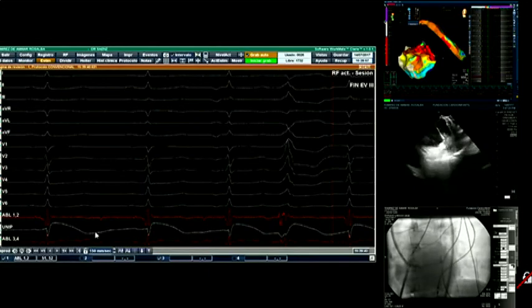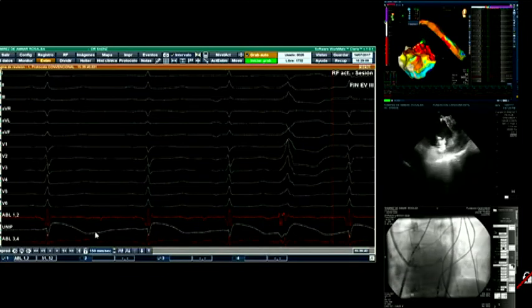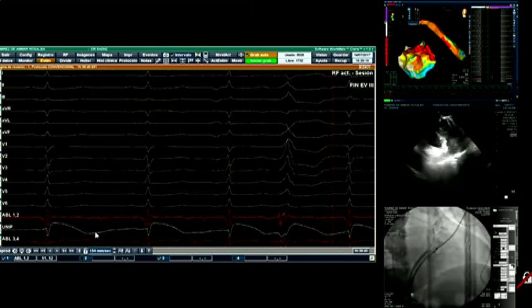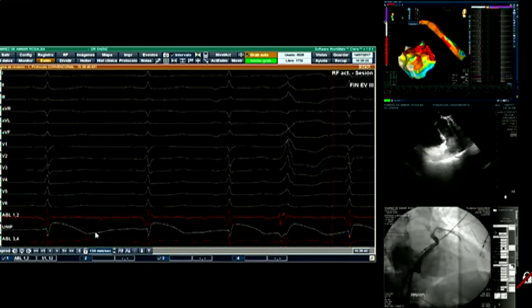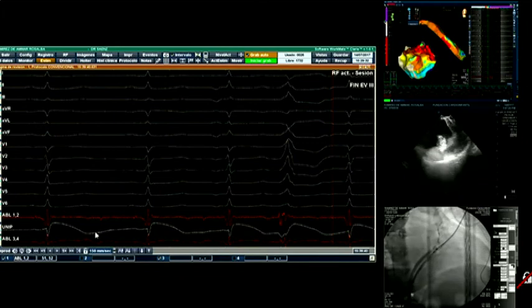But what I say is that in this case, we didn't do any extraordinary manipulation. This is very simple. The reason for the previous perforation has nothing to do with entering the coronary sinus. The reason for the previous perforation probably had to do with trying to place the catheter and the tip pushing upward, and they then perforate the venous portion. But if you place a sheath of this type with a guide wire and you do a venography, today I don't see much of a risk of perforation. And this 3 French catheter, which has tip protection, it's going to be very improbable for it to perforate.